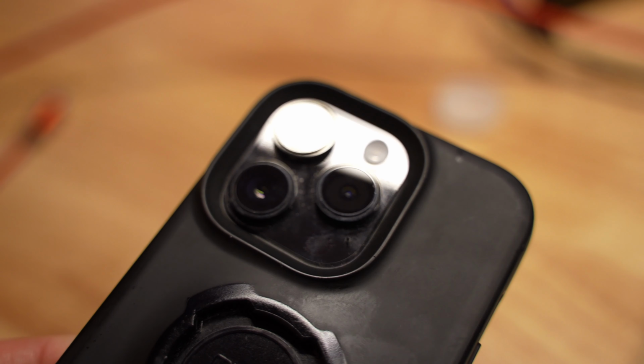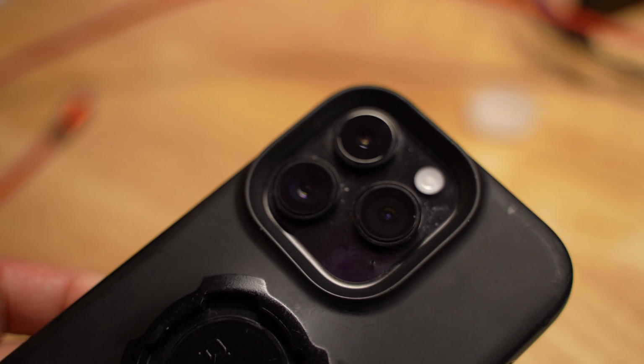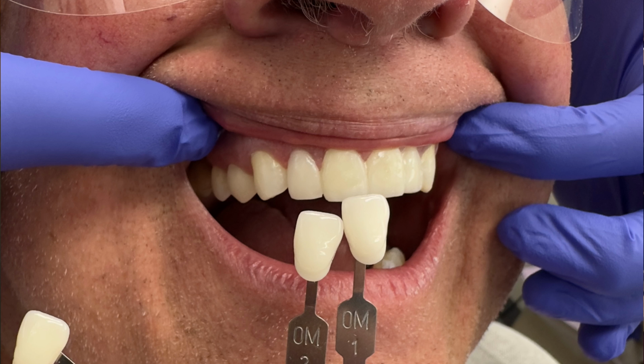I've been doing dental photography with the iPhone 14 Pro for probably like a year now, and these are some of the pros and cons of using a mobile phone for dental photography. I want to start off by saying that I use the phone periodically to get shade matches and pictures to send to the lab whenever we're doing veneer cases or implants or whatever, and it's good for that. I'll say that it's really good and handy.